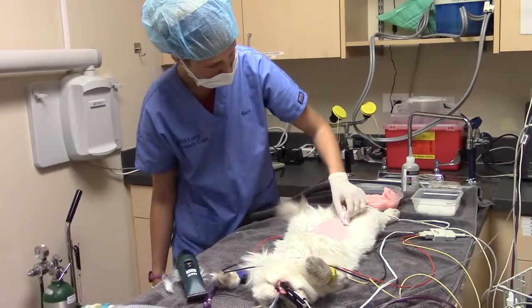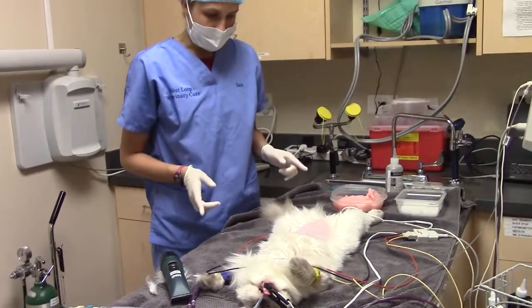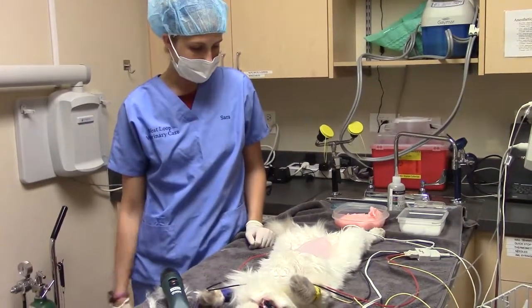When I'm scrubbing, I sometimes interfere with the leads, so Courtney's just been manually checking the heart rate. Now that that is complete, she's all ready — she is prepped and we are all good to go.